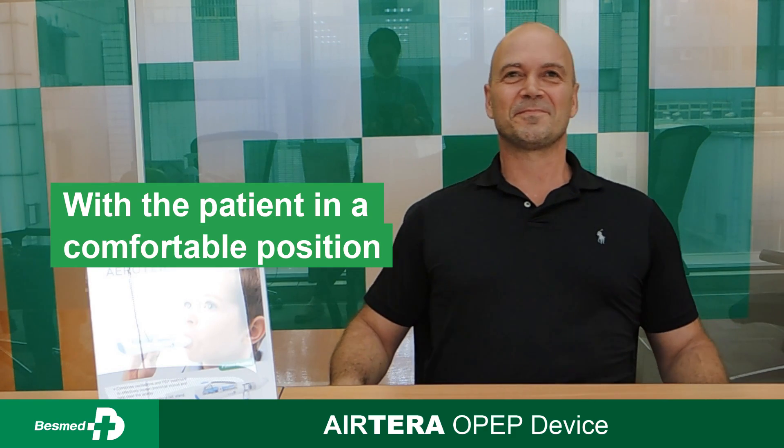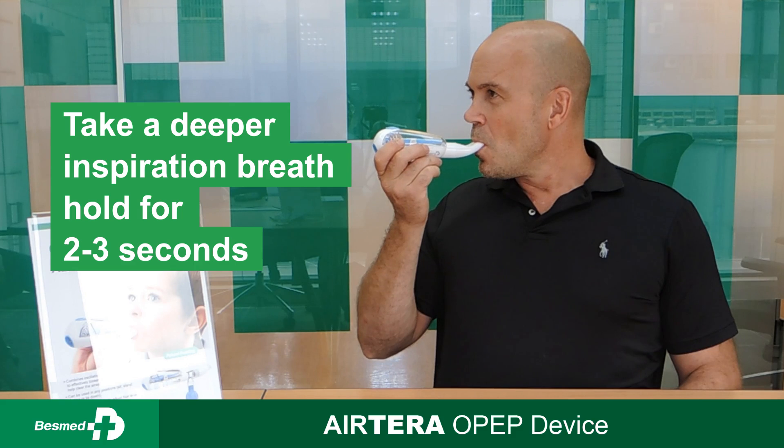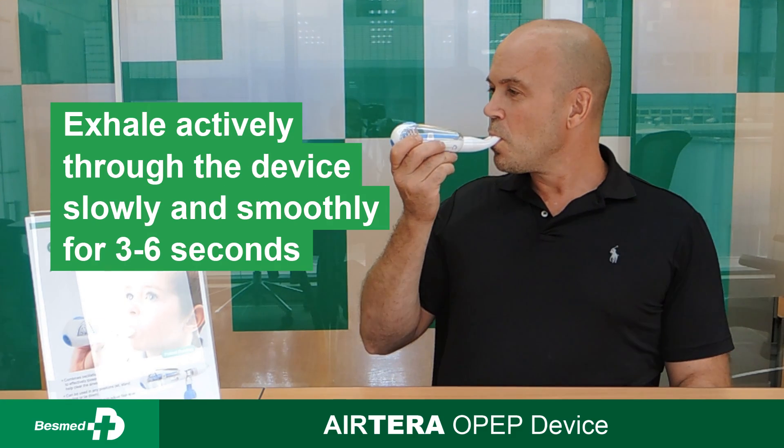Sit comfortably. Take a deep breath and hold for 2 to 3 seconds. Exhale actively.